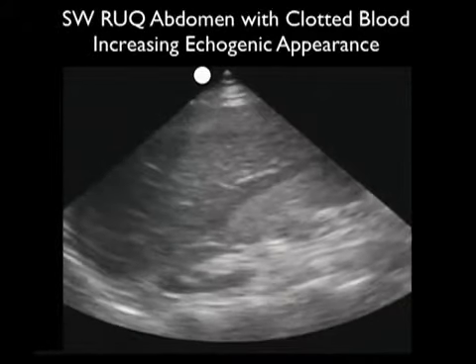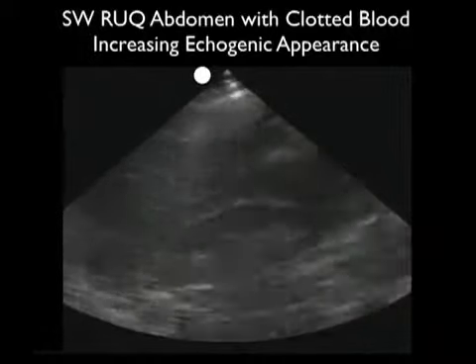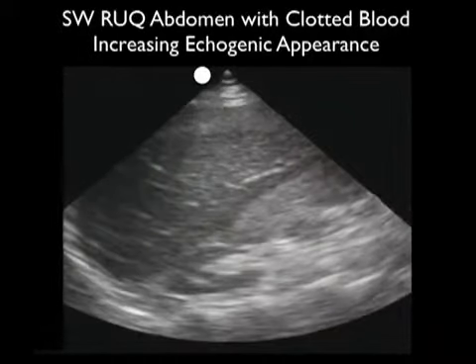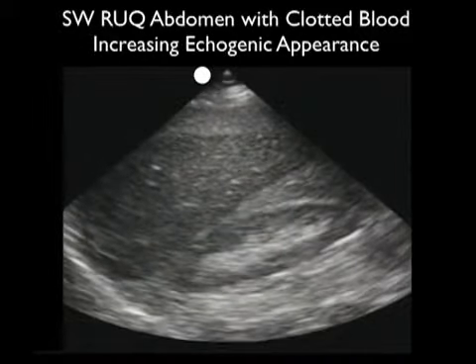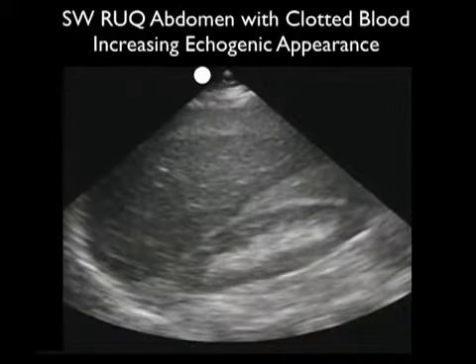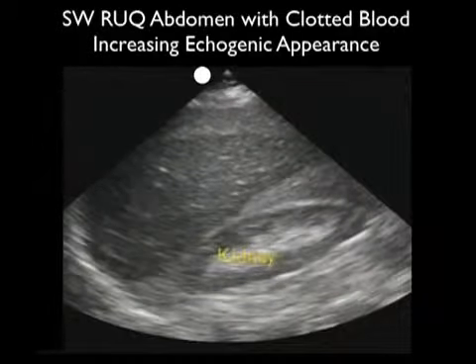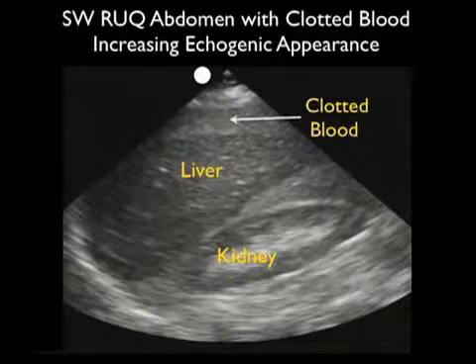In this video clip, a patient was stabbed and had a significant downtime before being brought to the emergency department. As we look at the hepatorenal interface, we see a large amount of clotted blood there, made up by that echogenic or lighter appearance of the blood. Notice that the large amount of blood extends into the right paracolic gutter as we scan inferiorly. And here we can see the liver, the kidney, and the clotted blood, that more echogenic or lighter blood, in Morrison's pouch.